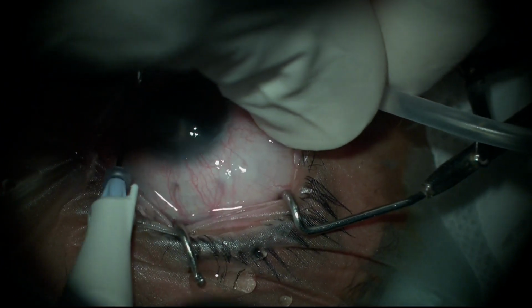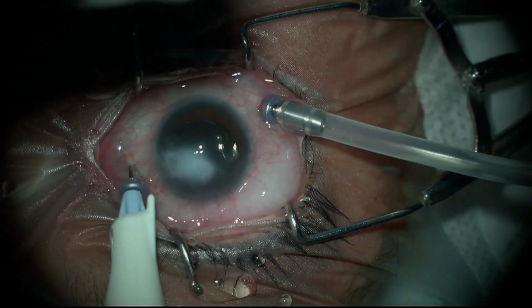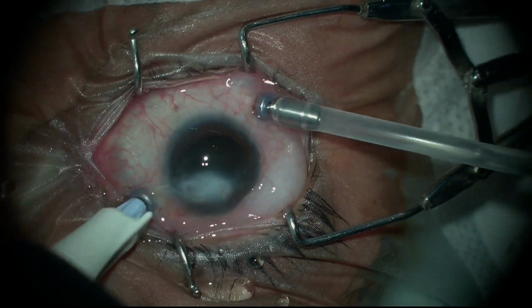I always wanted to make incisions which are self-sealing. कई बार वो नहीं बन पाता है.